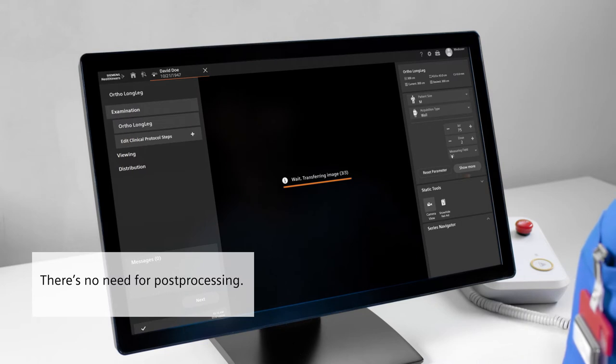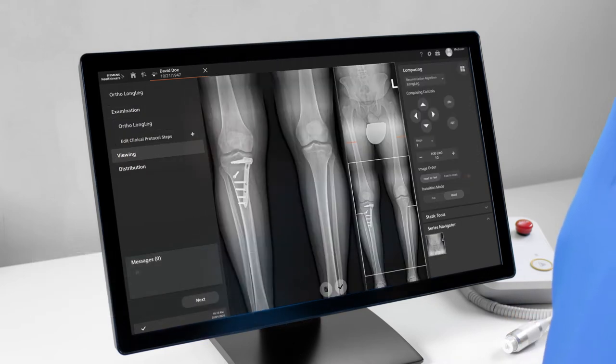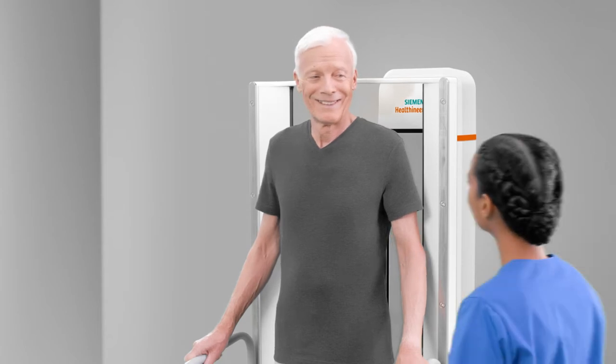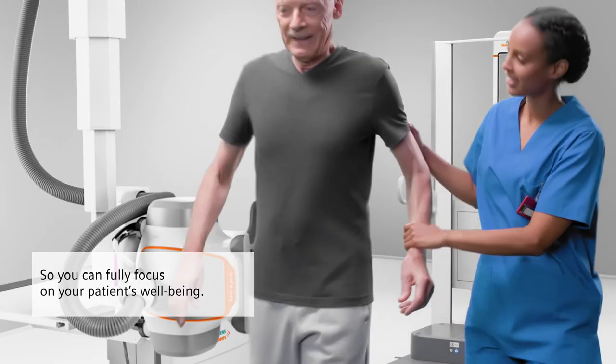By removing the need for post-processing, Smart Virtual Ortho allows holistic patient care. Auto-stitching composes and delivers the final image automatically. This means you can make sure patients receive the support they need.